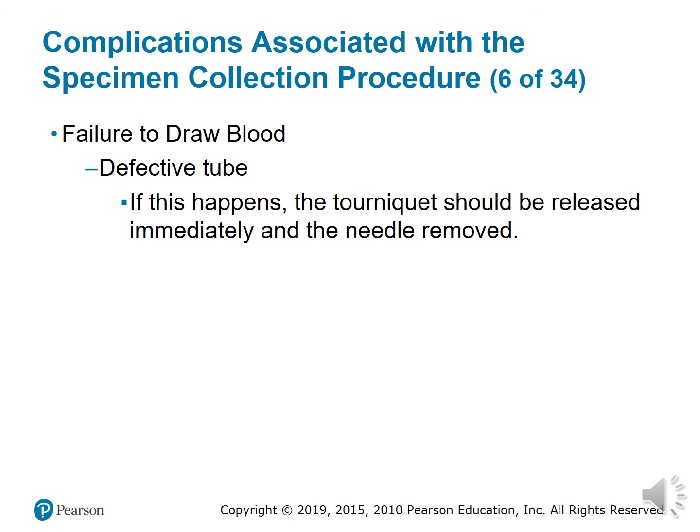As the top comes off and the blood is spilling all over the place, we definitely don't want that. It's going to freak the patient out. It's going to freak you out because you're not going to understand what's happening, and because you're freaked out and the patient's freaked out, it's a catastrophe.